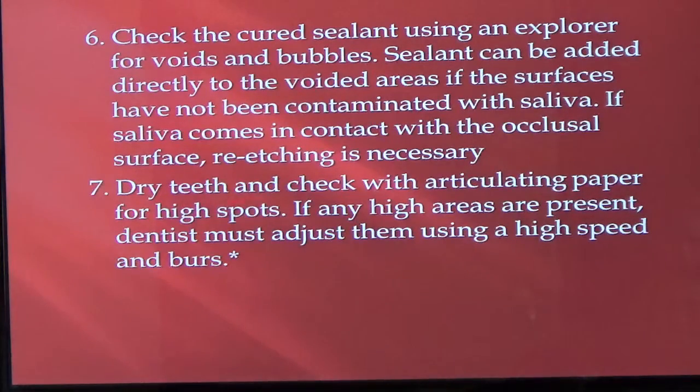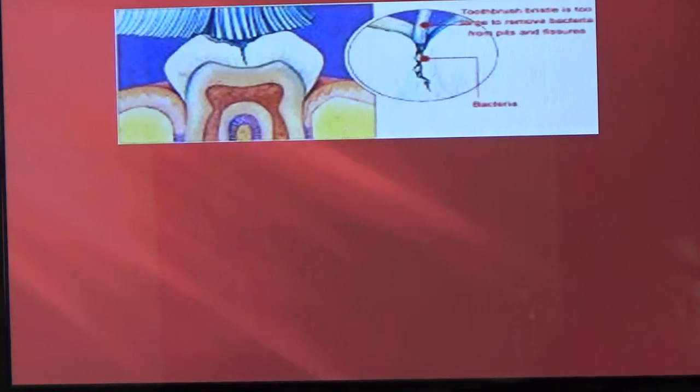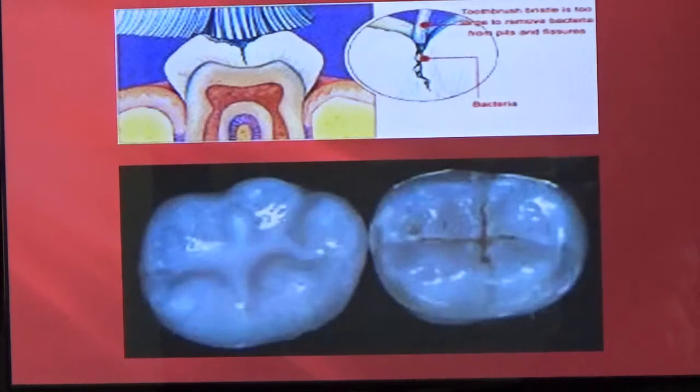Dry the teeth, and you're going to check the bite, like we said, and you do have to adjust. Okay, there's no such thing as you do the sealant and you just let them go. Because if you don't check the bite and they're biting on it, you're doing them more harm than good. Because it's going to fracture, and when they come back, they may have a cavity on a tooth that didn't have a cavity. Again, those are the fissures that kind of travel down into the tooth.